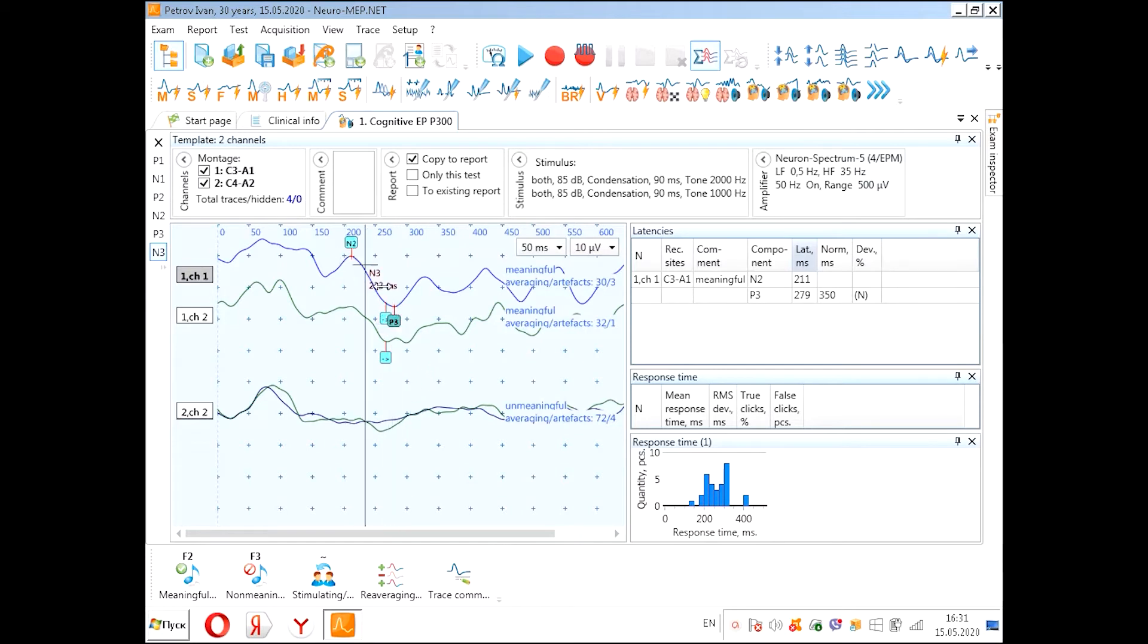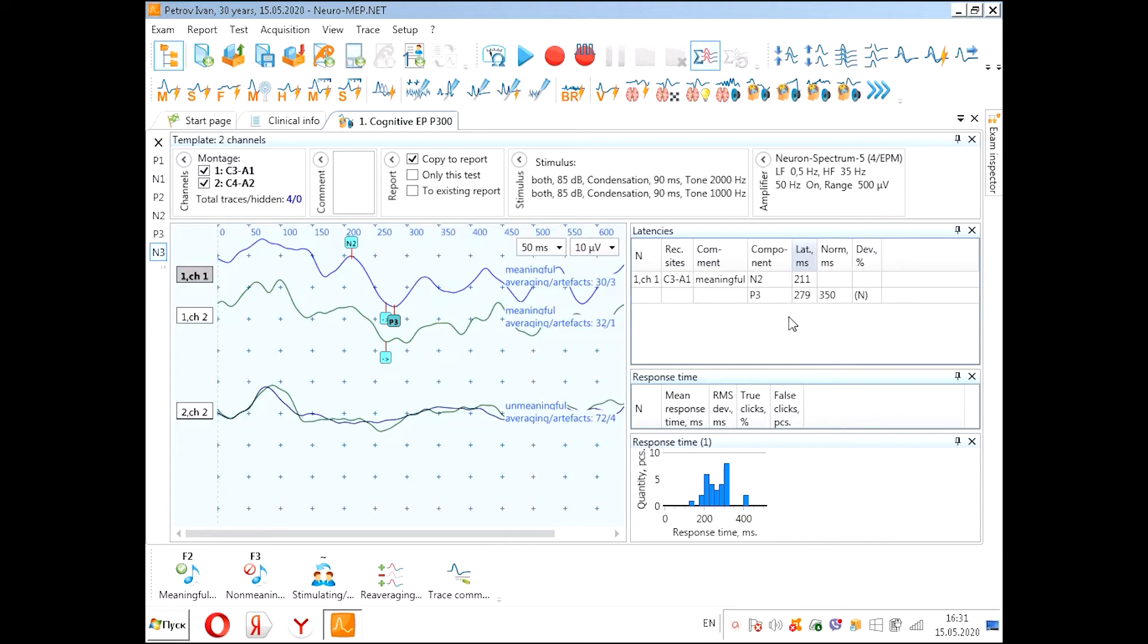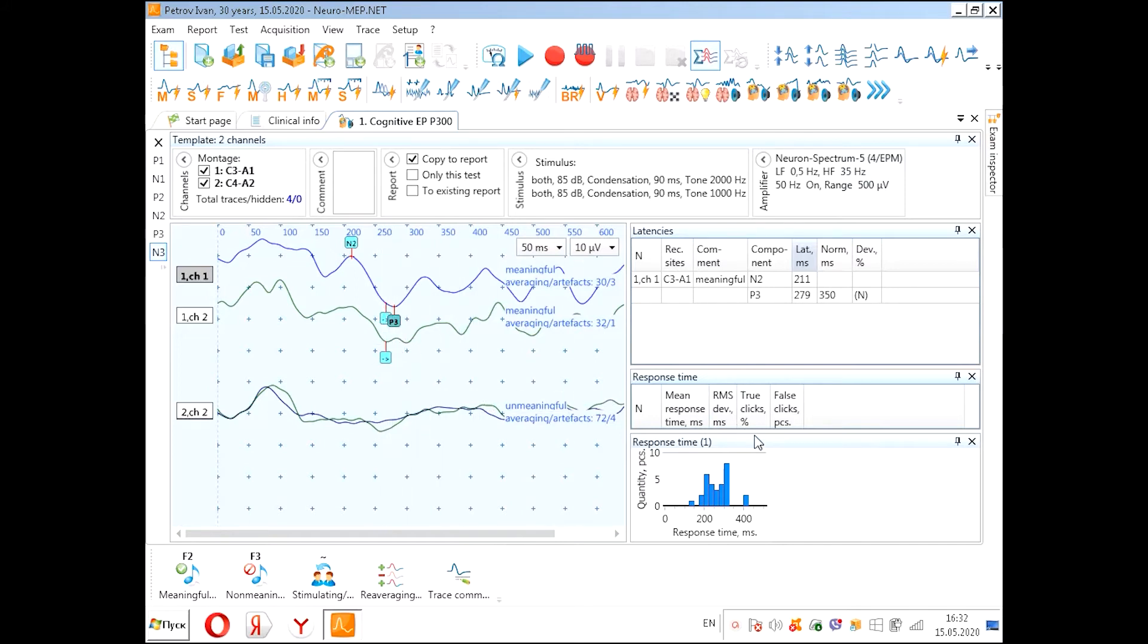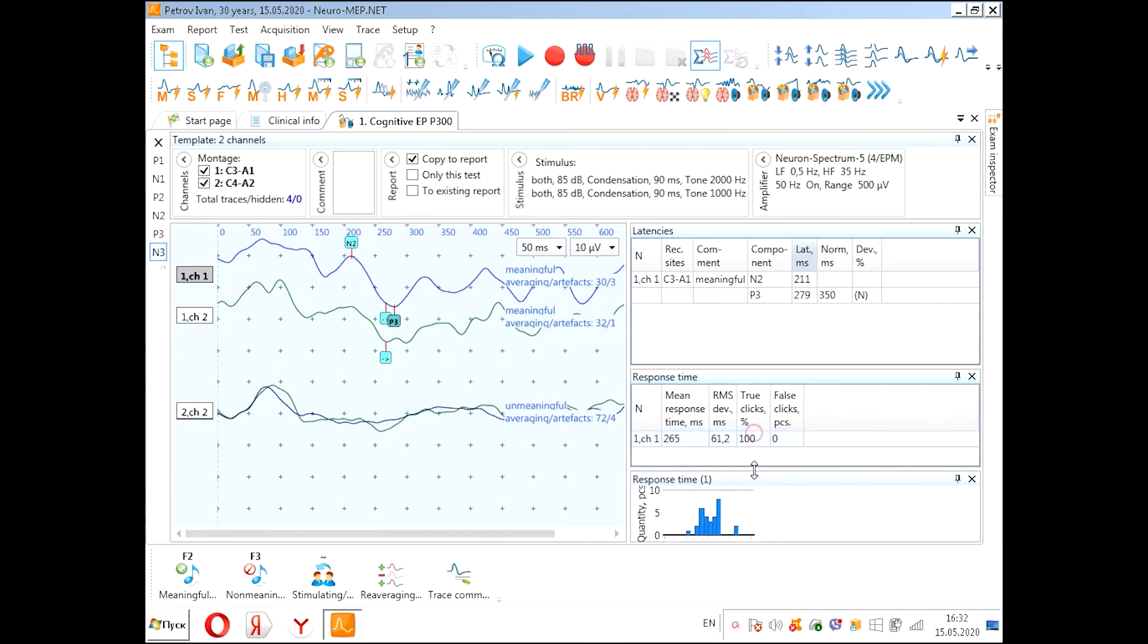We can put the markers and we see the latencies here. Also, as we have used patient button, we see the time of reaction here. And we can see the details here. The mean response time is 265 milliseconds.